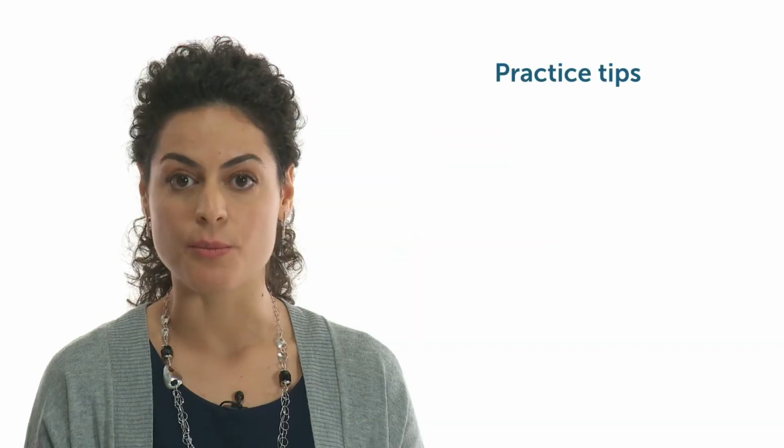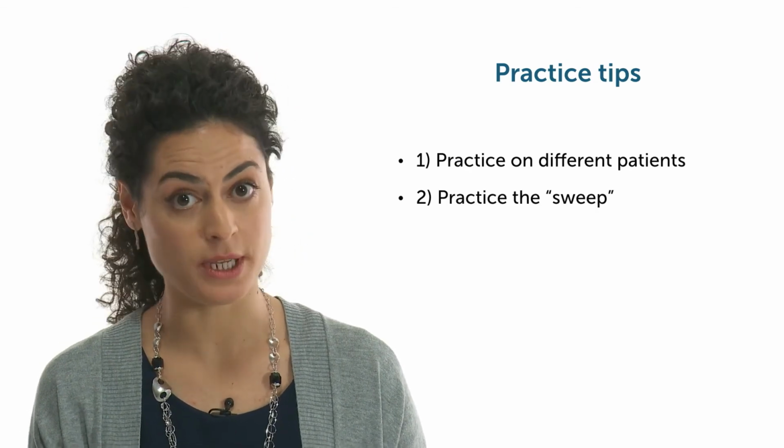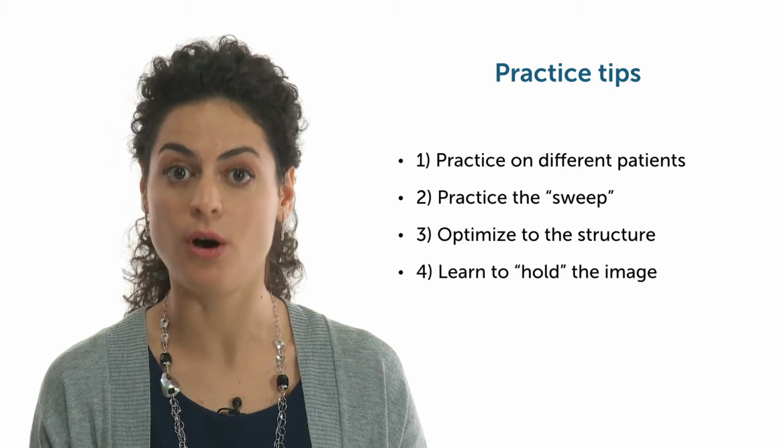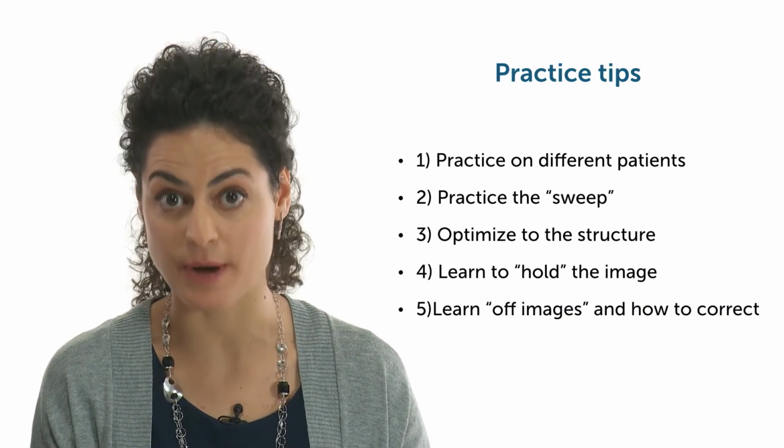And here's some practice tip, which applies not only for the parasternal view, but to every view. So practice on different patients, practice the sweep, optimize to the structure, learn to hold the image, and learn off-axis images and how to correct them. Thanks, Anna, for these practical tips and for the summary. But I think it's time that we really practice and now go to some case studies that will help you in your daily clinical practice.